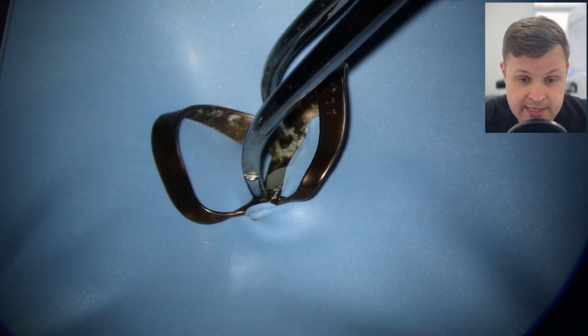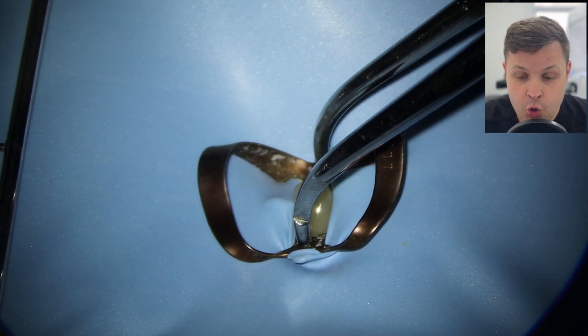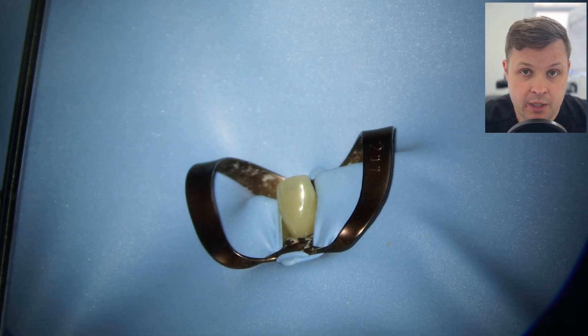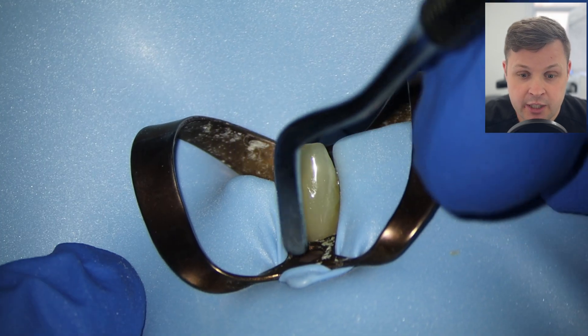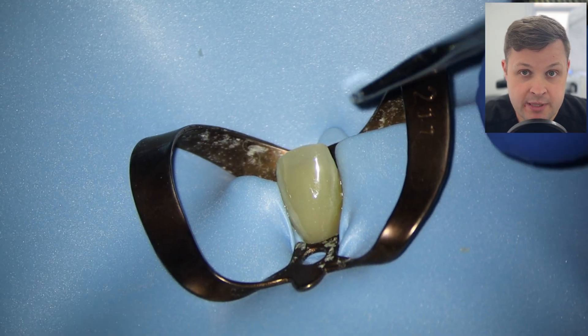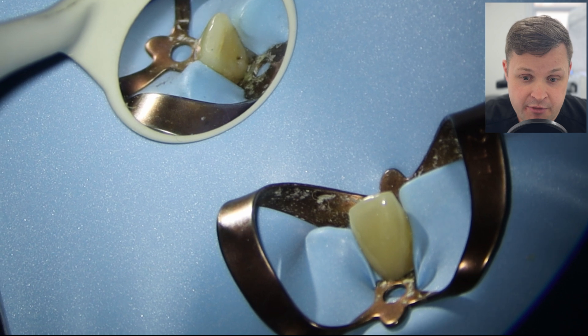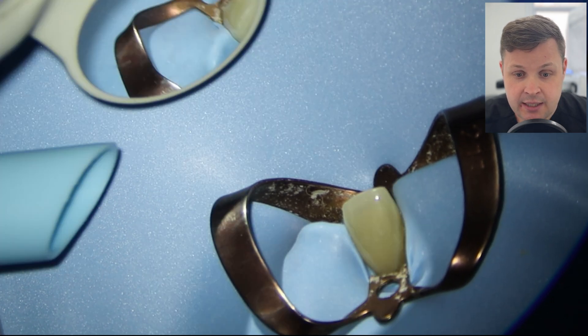The very first thing we want to do is place the rubber dam. Again, I've mentioned this before: no rubber dam, no root canal. There are absolutely no ifs, no buts on that one — you 100% need rubber dam for root canal, mainly for safety and also for cross infection control.